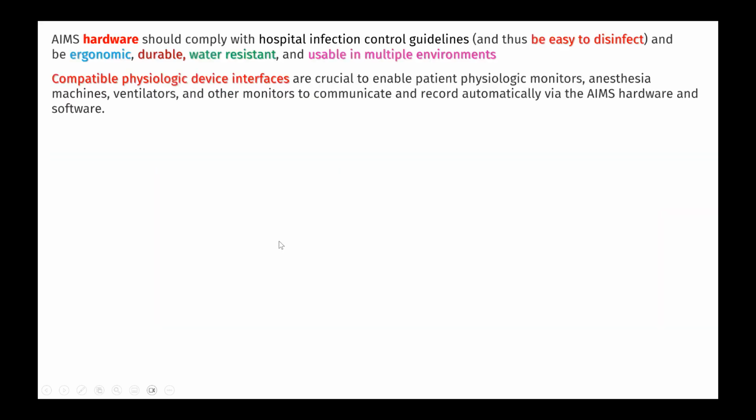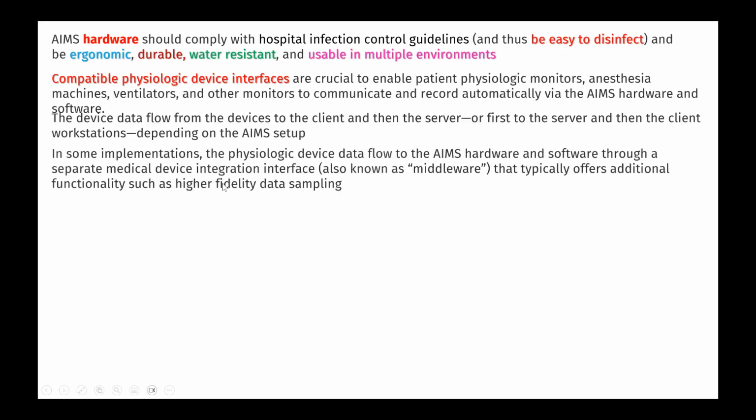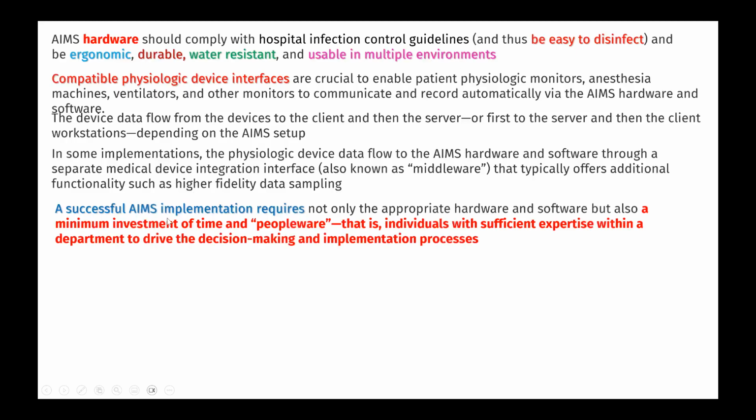These are all a little more detail about the hardware and the compatible physiological device interface. And I think I have to emphasize all these things. A successful AIMS implementation requires not only appropriate hardware and software nowadays, but also a minimum investment of time and peopleware, because many people are still wary about using this.